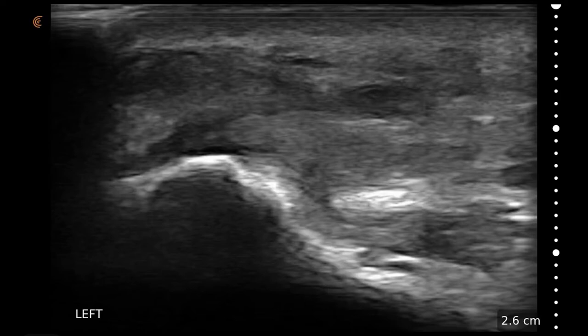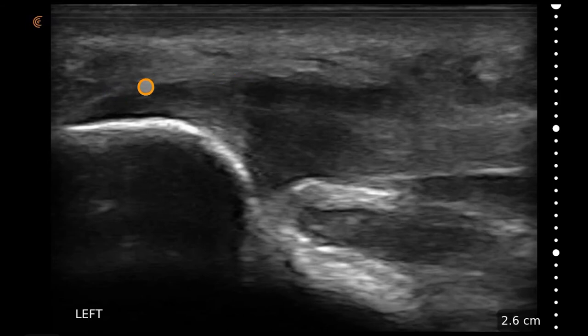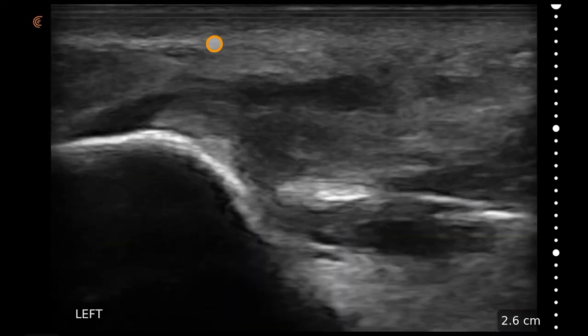Placing the linear scanner in the longitudinal axis of the foot can identify here the calcaneus again with its bony shadow. Normal plantar fascia should insert here at the base of the calcaneus, and here we see a significantly edematous plantar fascia that measures approximately one centimeter in its height from the edge where it inserts on the calcaneus. This is essentially diagnostic of plantar fasciitis with such a large area.